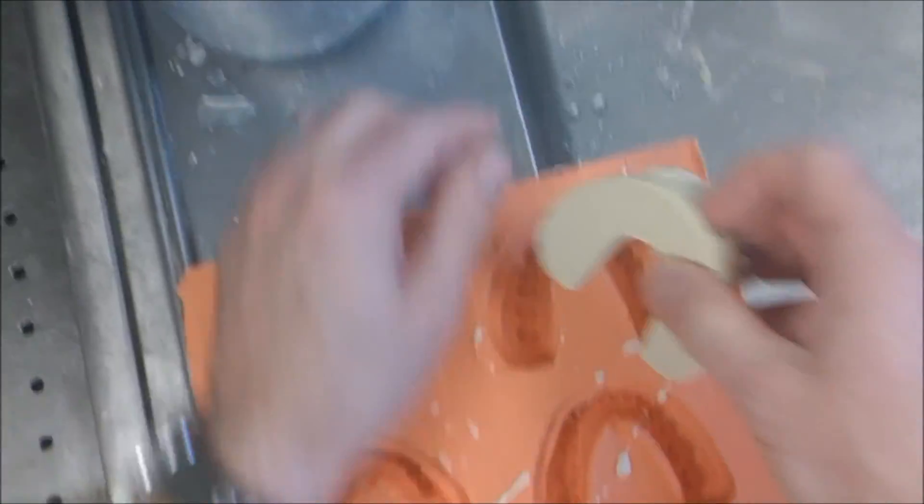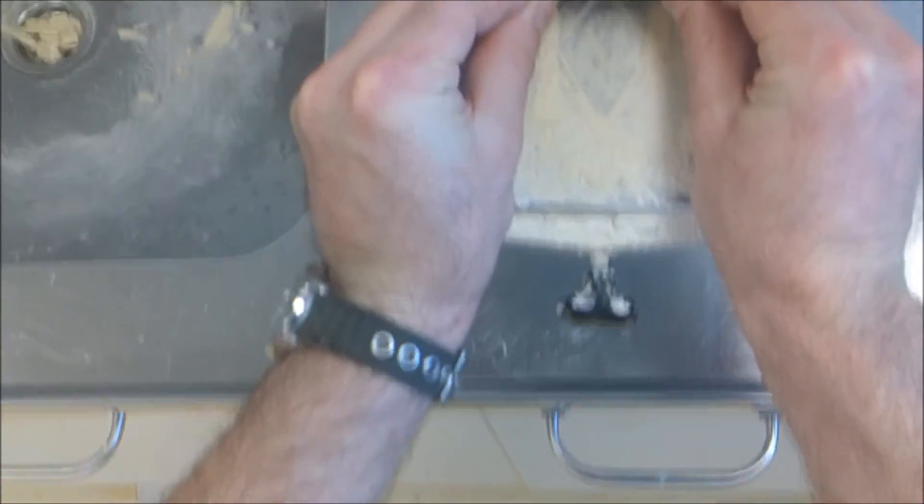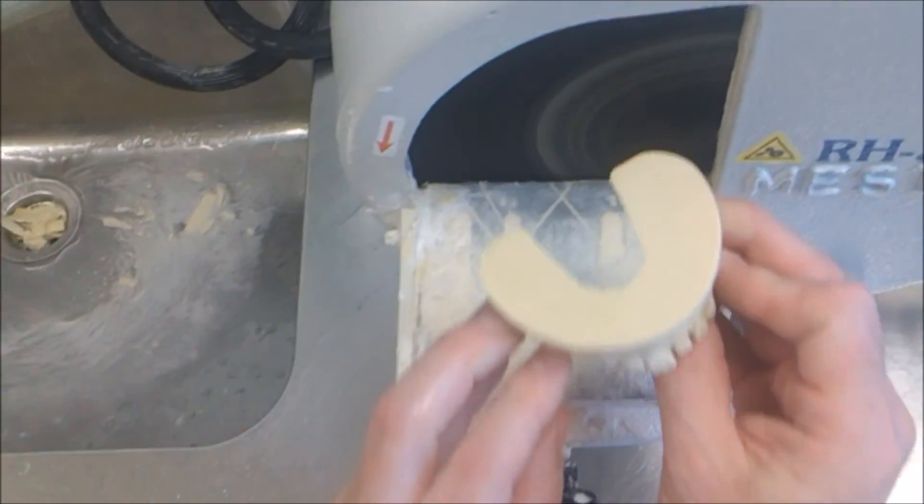I'm just going to dress the base on the model trimmer. Turn the model trimmer on — water should automatically be pumped through — and I'm just going to dress the base there.